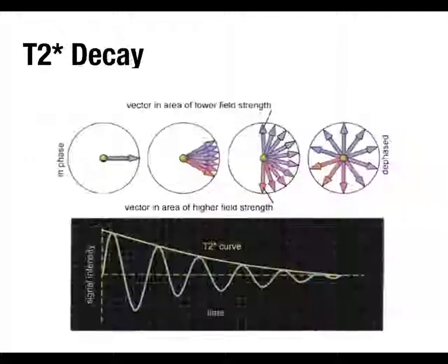And the parameter that we're manipulating or playing with in the MRI sequence is actually the T2 star decay. So remember last time, the T1 recovery is where you send the RF pulse in, it tips the net magnetization vector into the transverse plane, where you're actually measuring the signal, and then it slowly recovers. So that's your T1. Your T2 is that when you tip it into the transverse plane, you're also causing phase synchronization. So all those atoms that are precessing are all synchronized, and they're precessing together in synchrony, right?